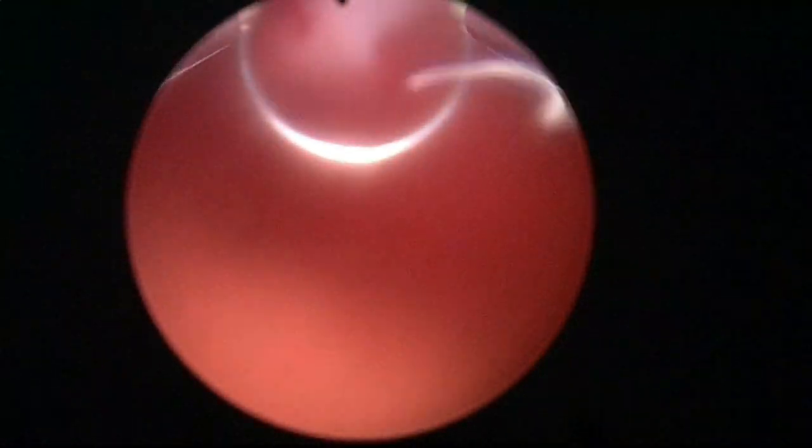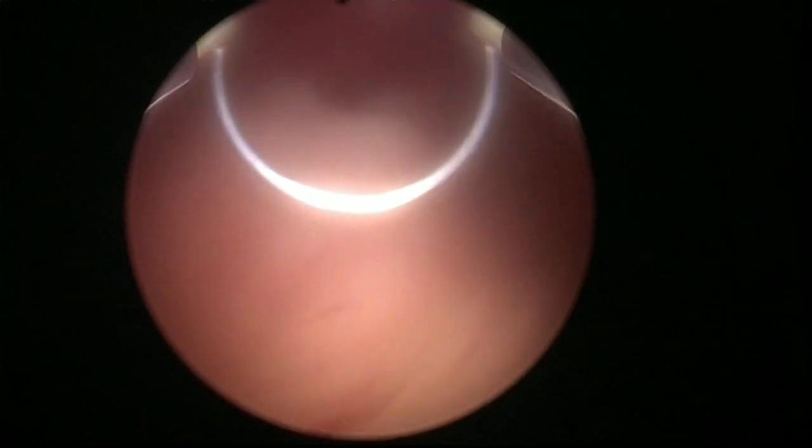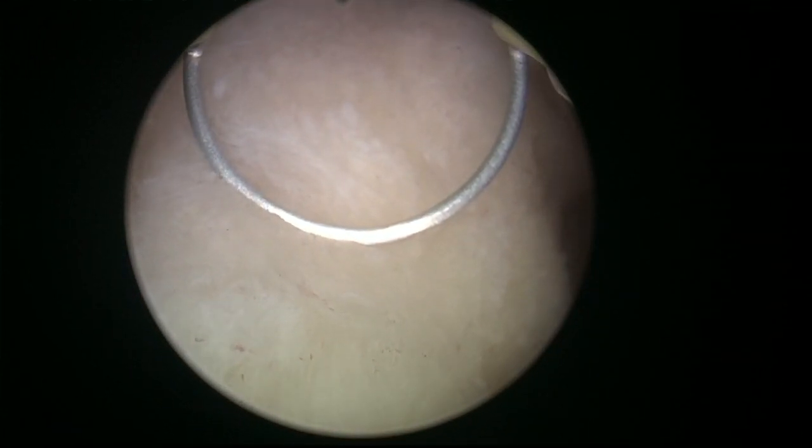It's a piece. I think it's the one that we tried to lure into the fossa before, but of course the visibility in the fossa was not so good, so we lost it. Where is it? Vamos, está. Some problem with the electrical connection. No, I think we can pull it out. Let's try. See if I can cut on the piece.